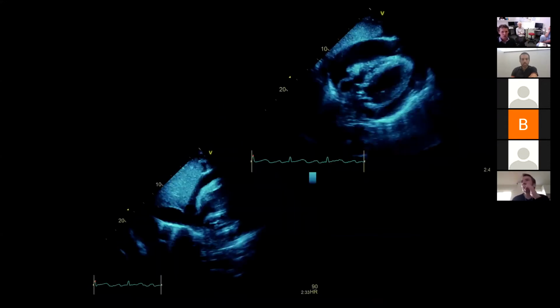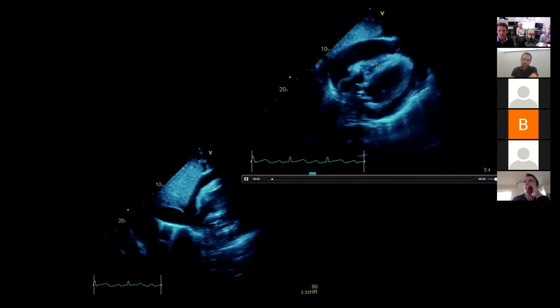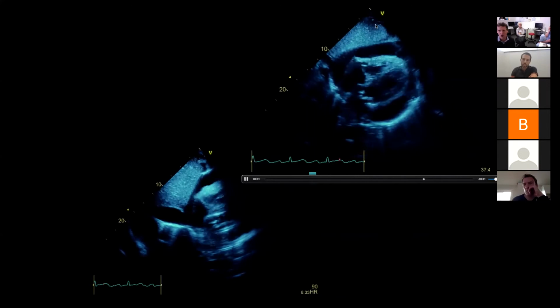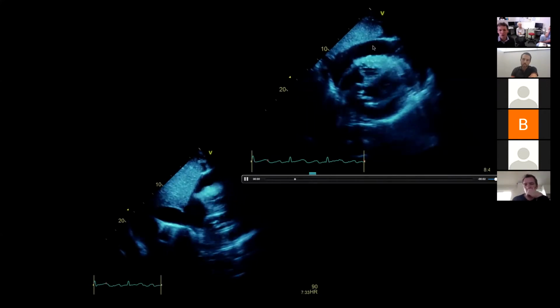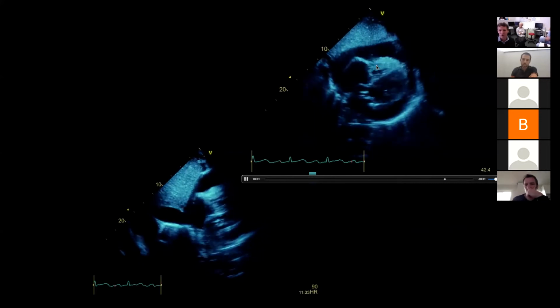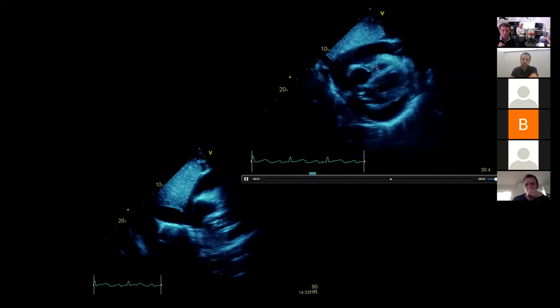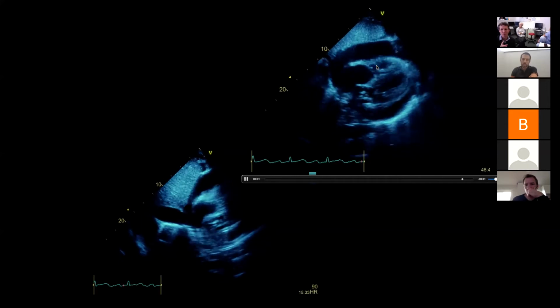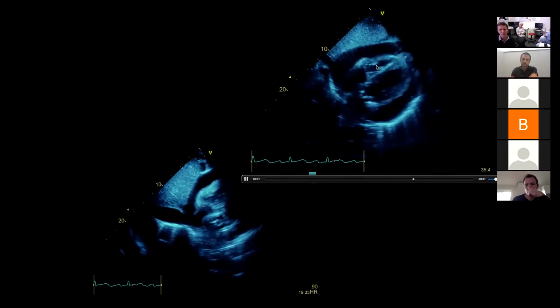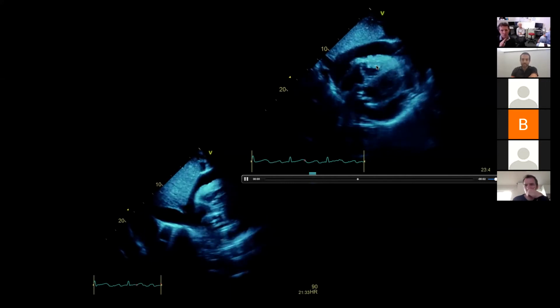So for example, the risk here, if I go subcostally, I see I've got to go through about 5 centimeters of liver. So I go, okay, we do hepatic biopsies all the time, but still 5 centimeters is a long way to go. I've got a decent landing zone here of about 3 centimeters before I hit the right ventricle. But if I am going to hit anything, it's better to hit the right ventricle than the left ventricle. People can die from hitting the left ventricle. And I've been reliably told by a cardiothoracic surgeon that you can't die from having a needle inside your right ventricle. I don't particularly want to test that theory out, but the idea is if you're going to hit a ventricle, hit the right one, not the left one.